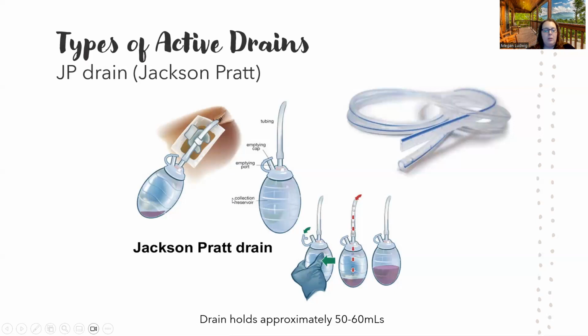squirting it into something acceptable. Okay, and I'll just put it in the trash, and then starting the whole process over. So typically these hold about 50 to 60 mLs or cc's. So keep that in mind.